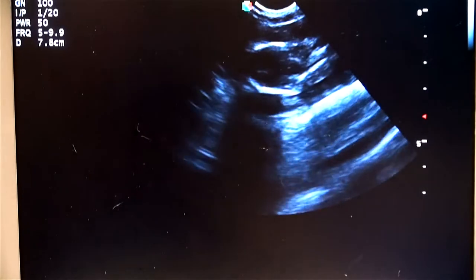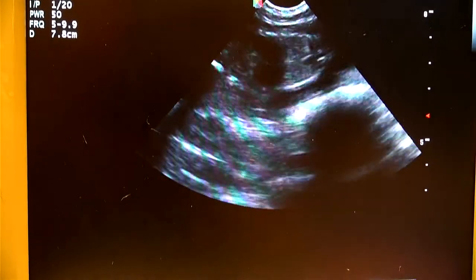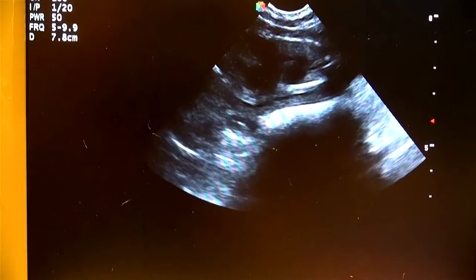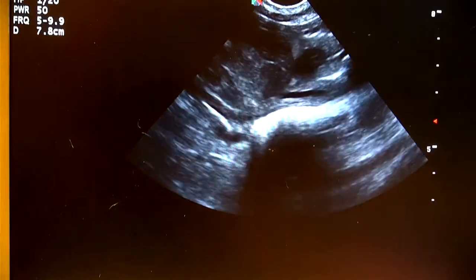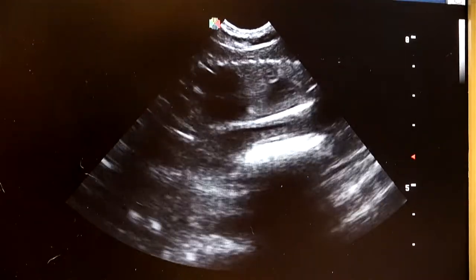On the left-hand side there is the head, and if you zoom in, you can actually see her heart beating right there. And I can actually watch her heartbeat and calculate an appropriate rhythm. There's a nice image of the heart beating there.